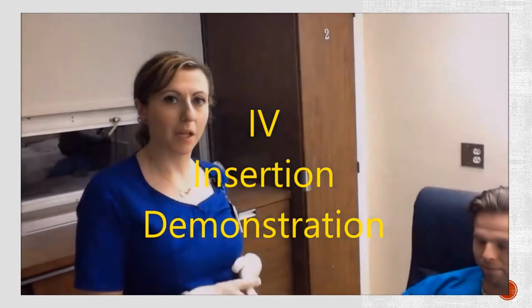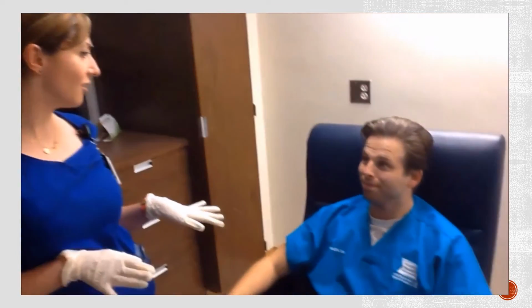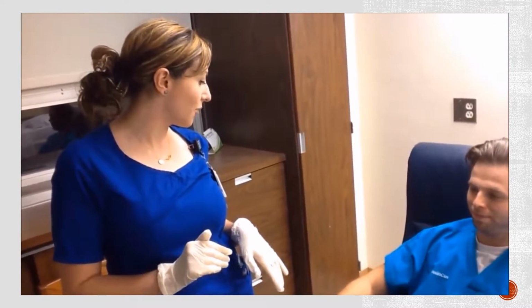My name's Perdita. I'll be doing the IV insertion on you today. Do you have any questions? Okay, so I've washed my hands, performed hand hygiene, I've got gloves on. So now I'm going to start the procedure.